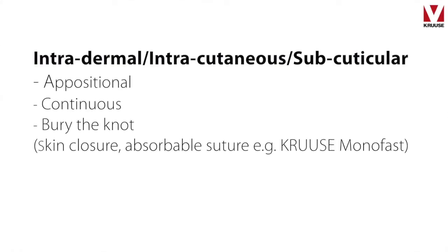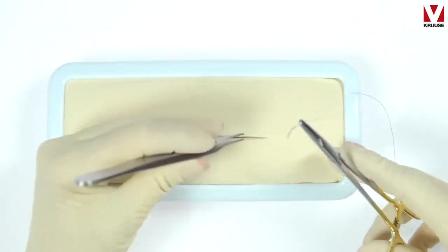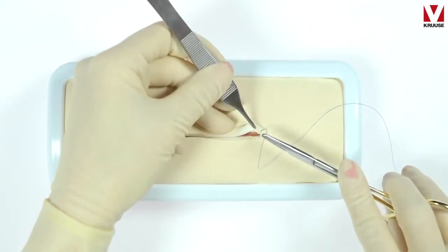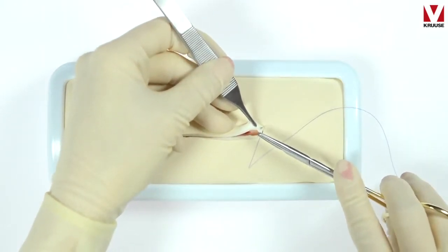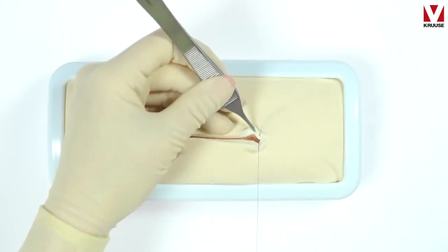Intradermal, subcuticular, or intracutaneous suturing pattern. This is an appositional continuous suturing pattern where I will show you how to bury the knot. This is a very popular suturing technique for skin closure. I recommend that you use an absorbable, that is mandatory, and also a monofilamentic suture.